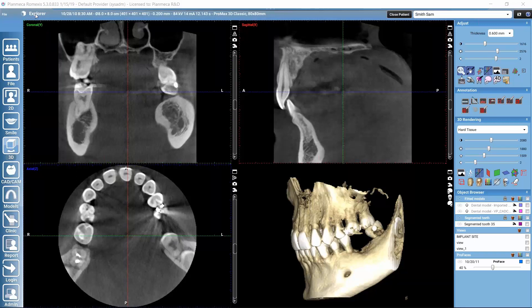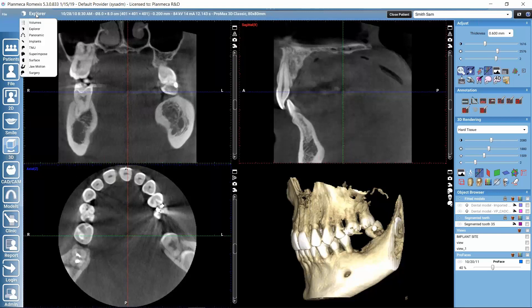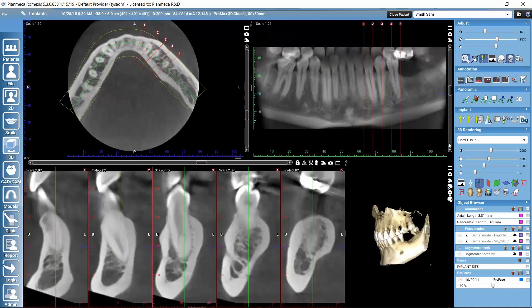If I click here on top of this 'Explorer' text, I can see the list of all the 3D sub-modules available in this license. I'll select 'Implants' here. This might be called 'Cross-Sections' if we don't have the implant planning tools included in our license — those tools will be covered in a separate tutorial.